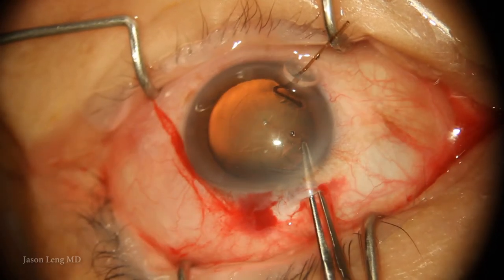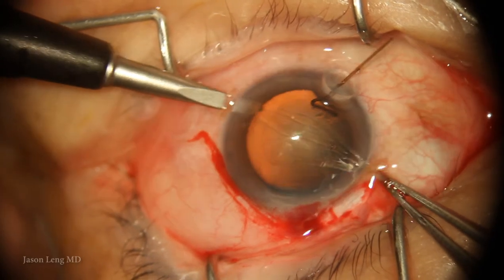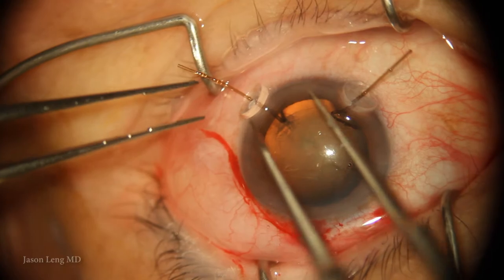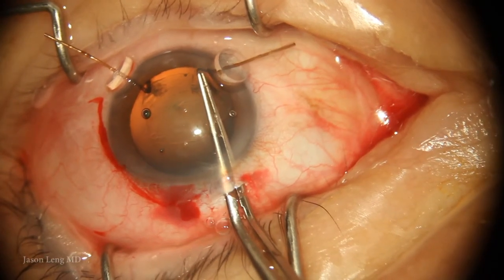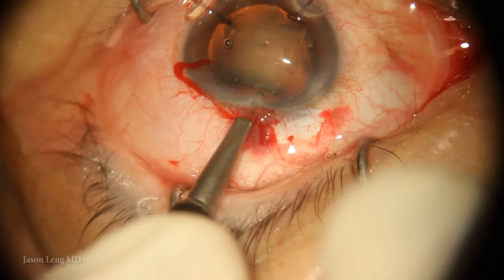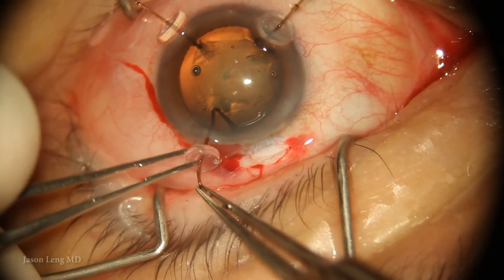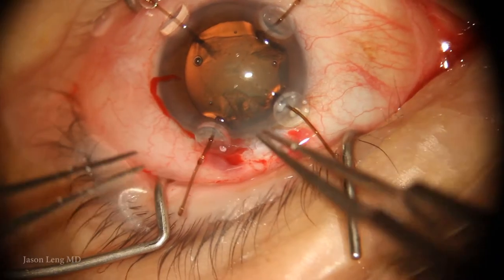As I pass the area where the vector forces aren't really supported by that zonular hook, I'm again having difficulty. So I go ahead and put another capsular hook and am able to complete my capsular rexis. Because the lens was so wobbly, I decided to place another two capsular hooks prior to starting phaco, just to give a little bit more support.